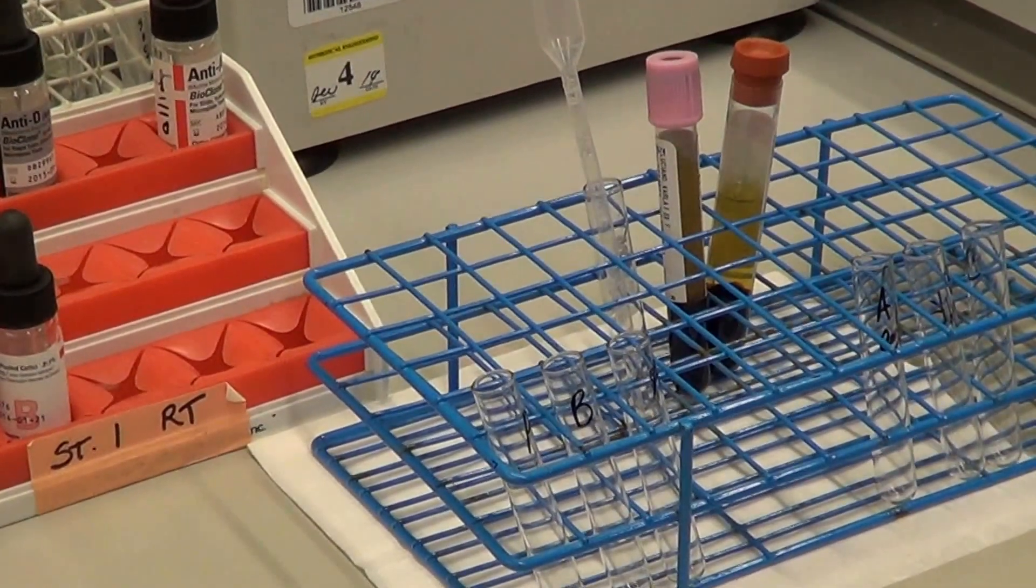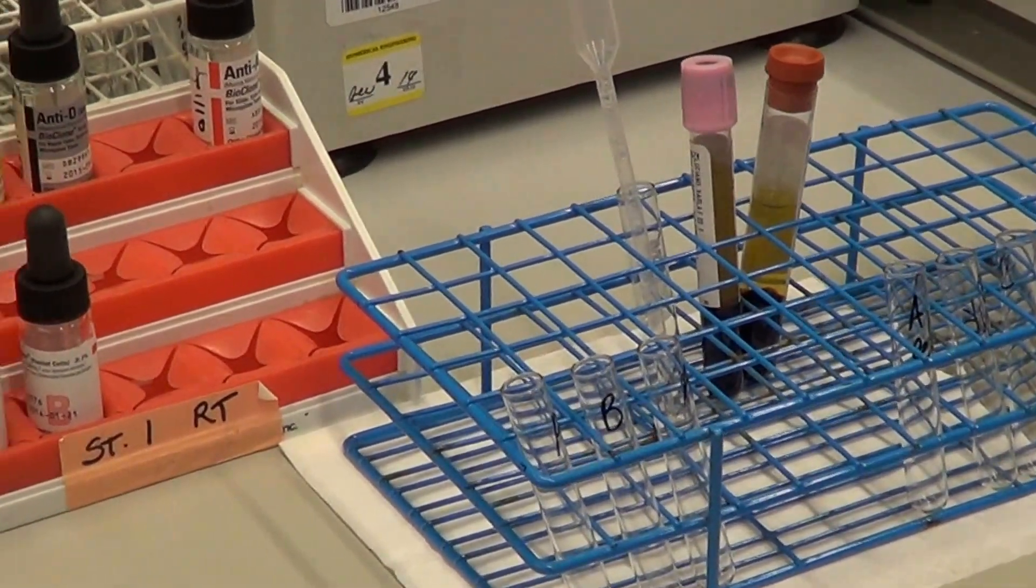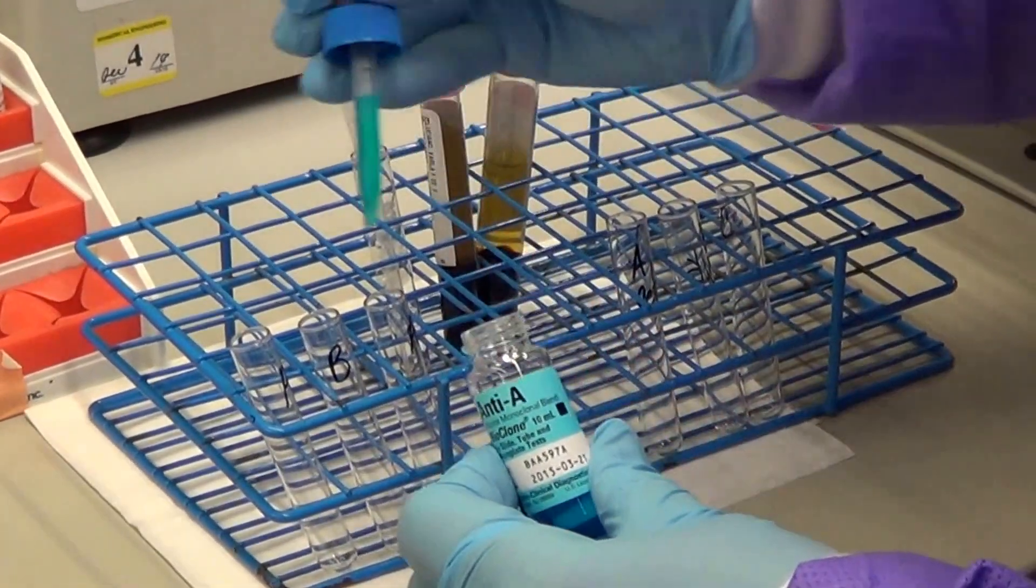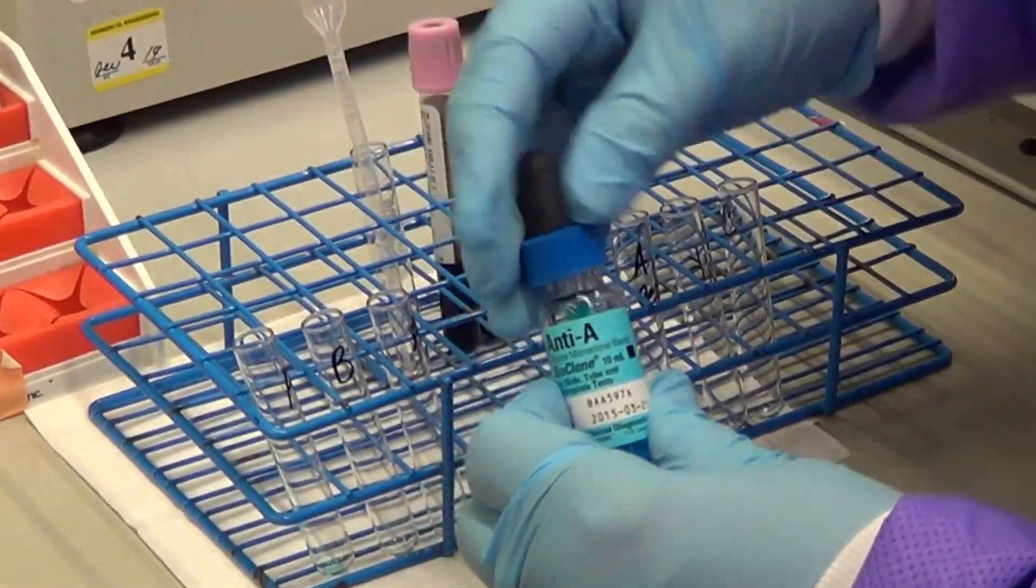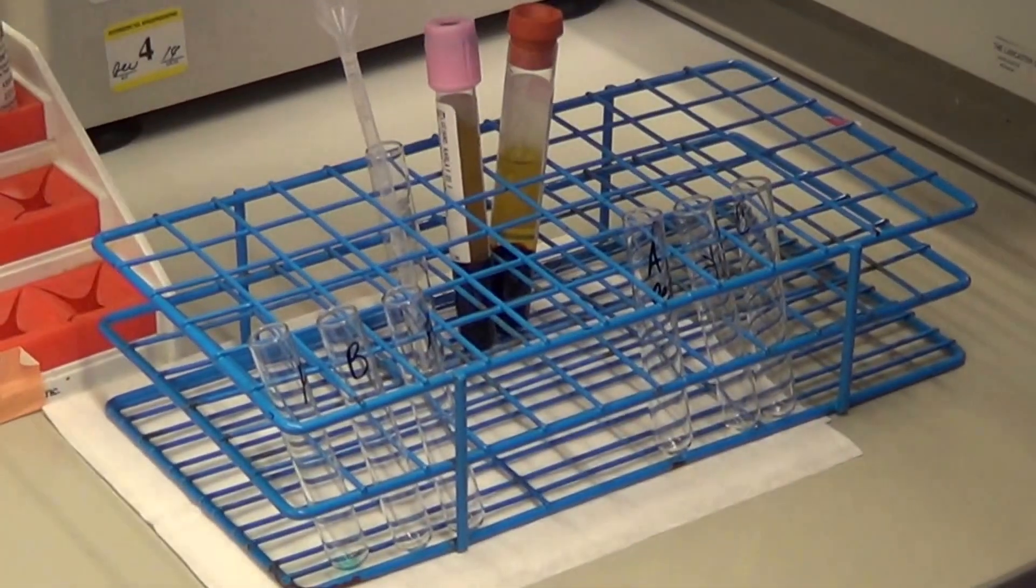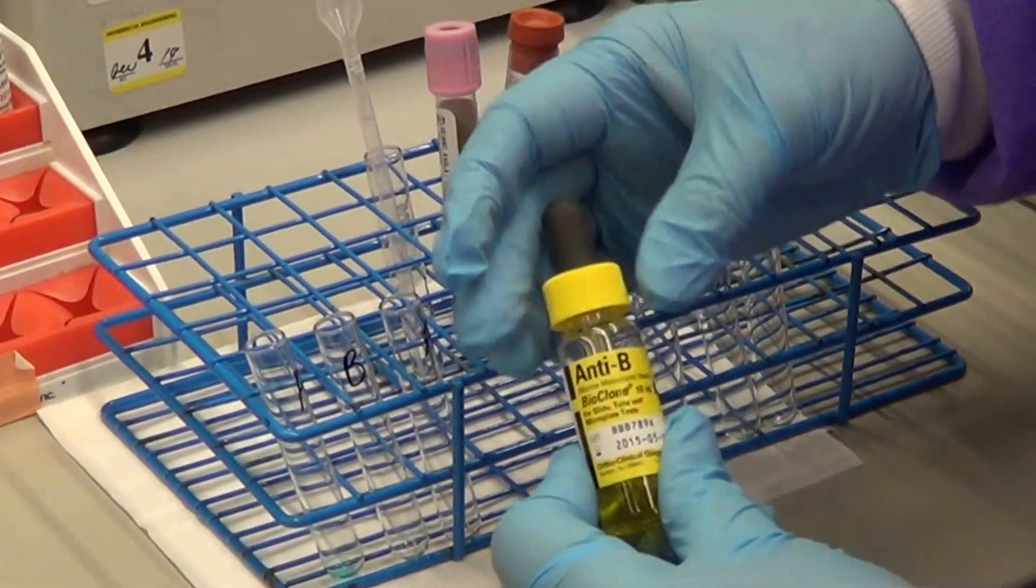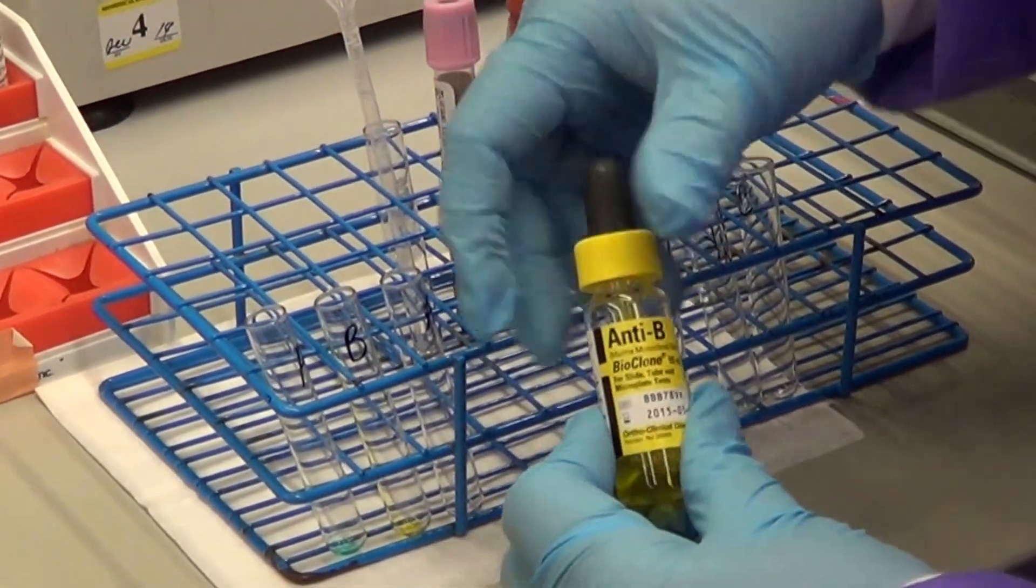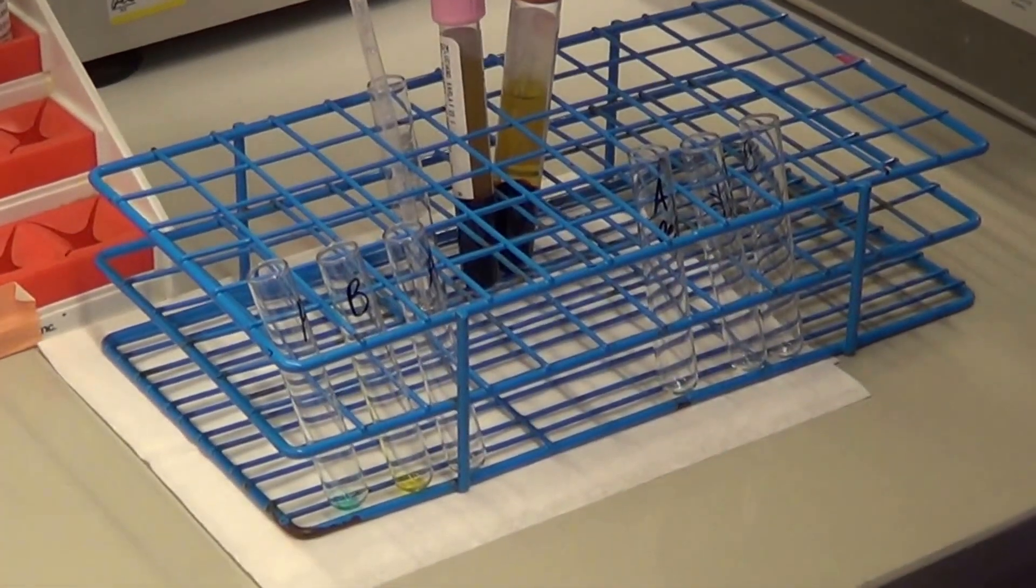We will now perform a blood type. The first step is to drop your typing reagents: one drop of anti-A, one drop of anti-B, and label them A and B.